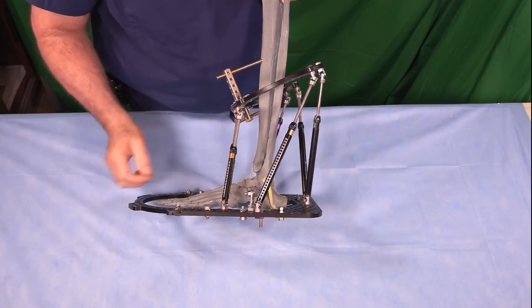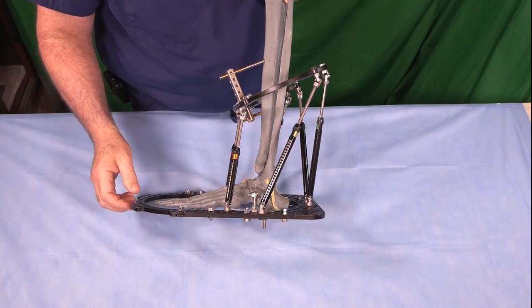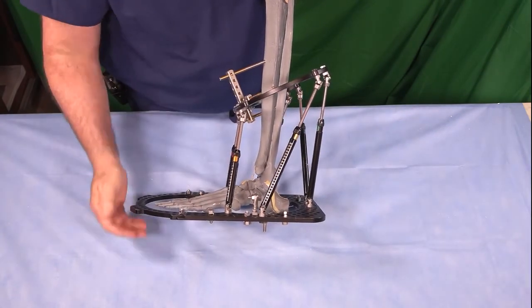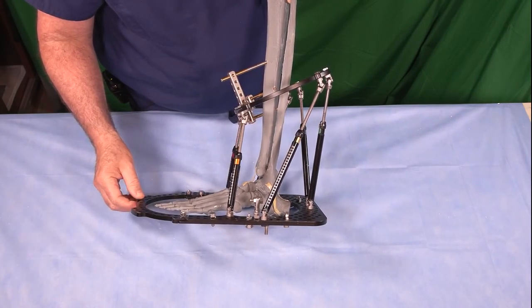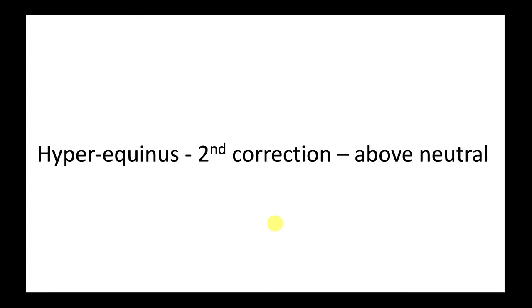If we stop here, even if we leave the frame on for 6 or 8 weeks, there's enough memory in the soft tissues behind the ankle that it will go back down into Equinus. So it's really important to overcorrect into dorsiflexion. So I'm going to go back to the computer, run a residual program, and tell it I want 15 degrees of dorsiflexion. We had a nice correction to neutral, but I strongly recommend that you overcorrect. So we're going to do a total residual and get a second correction to bring it above neutral.